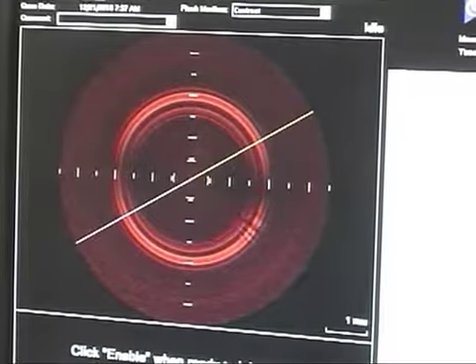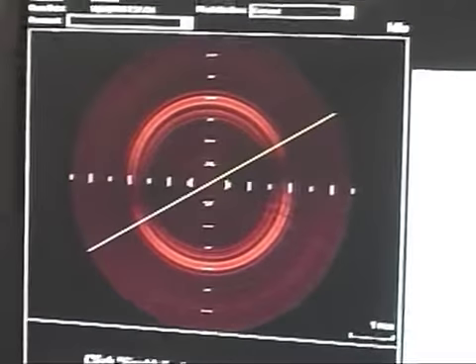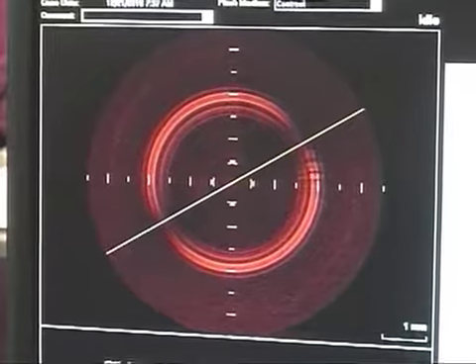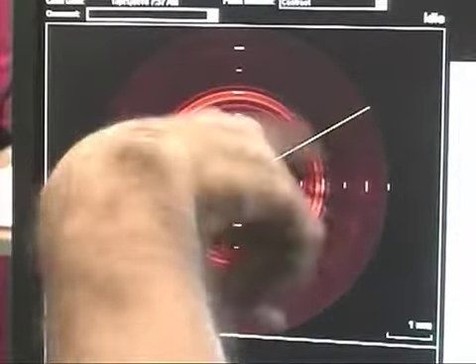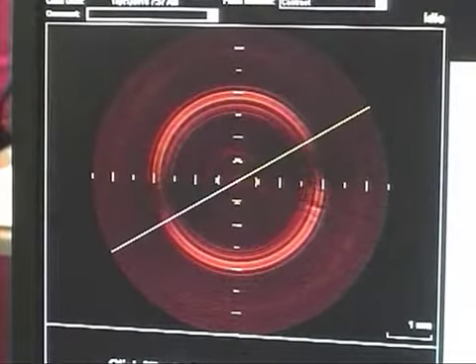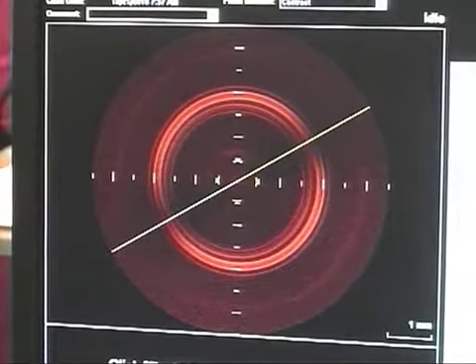Because it requires washout by the saline, hard injection with a dye or saline? Dye. With a dye. You want to try once again? Are you ready to acquire? Samin, how often are you using OCT already? What do you need now? Just inject hard.